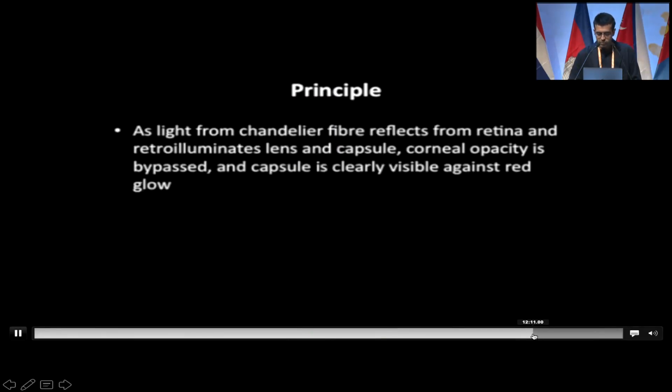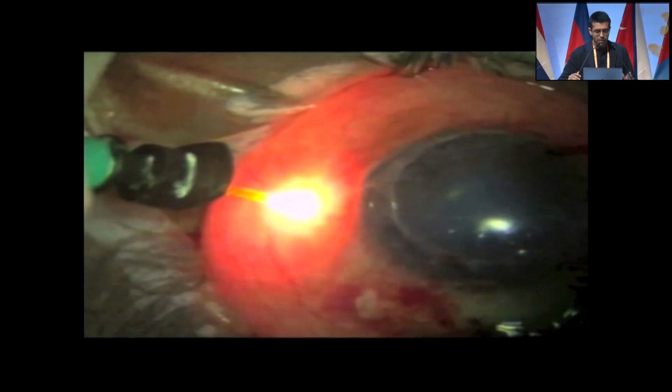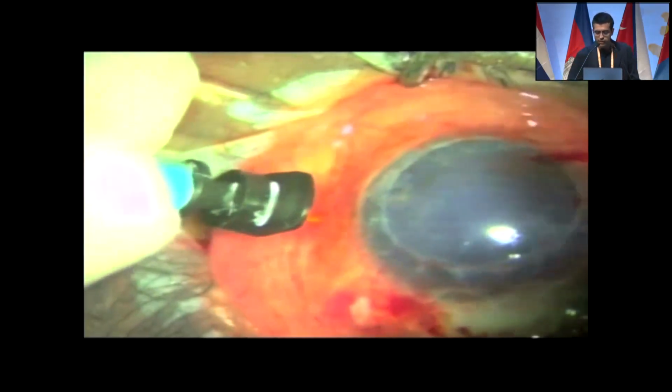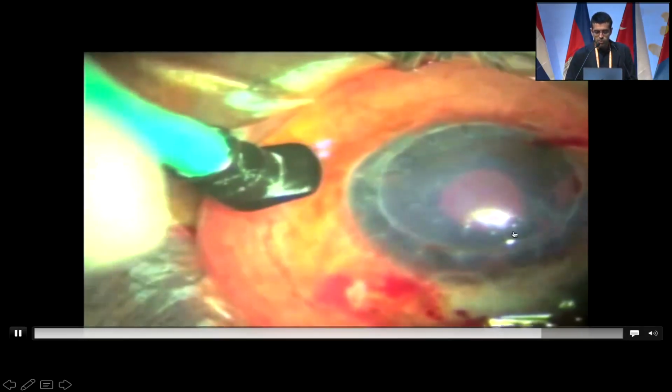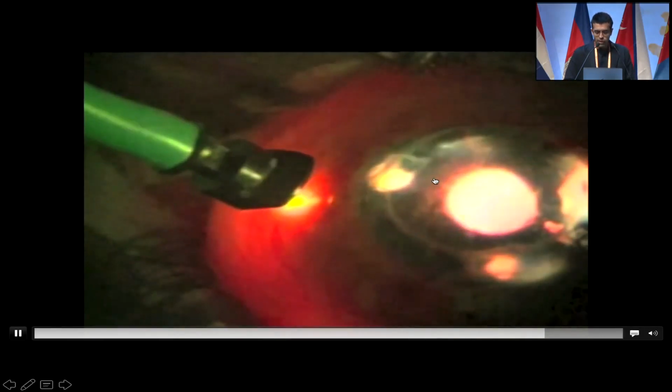Once that is done, this is how the post-op looks. Patient was 6/9 on day 1. So this is again a case that was a blast injury from Afghanistan that was referred to us. The patient actually had a very typical blast injury look, and you can see how this was a post-keratoplasty case. The multiple opacities in the cornea with no visualization, and there was a cataract.